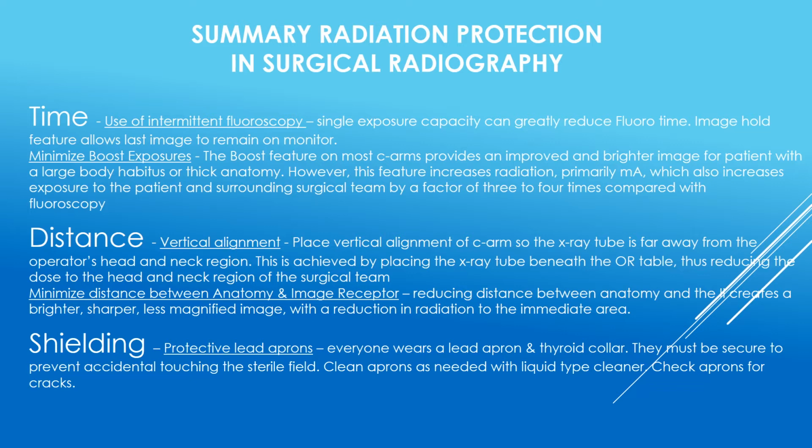Everyone wears a lead apron and a thyroid collar. They must be secure to prevent accidental touching of the sterile field. Clean aprons with a liquid type cleaner. Check aprons for any cracks.